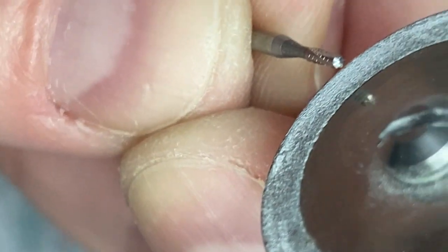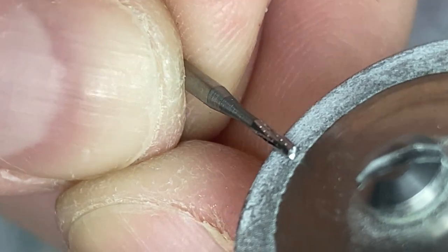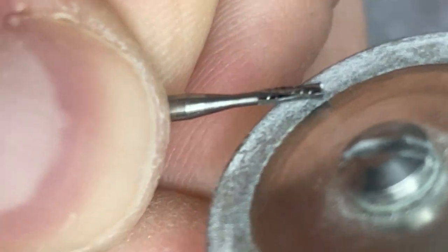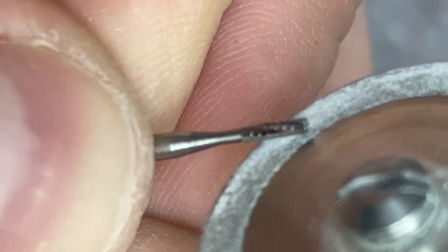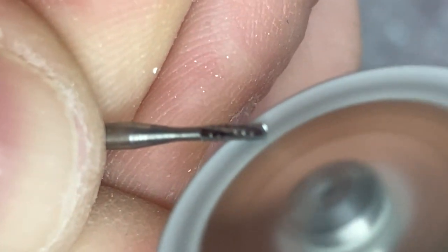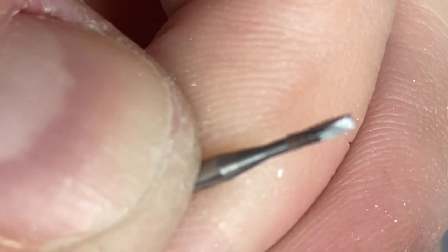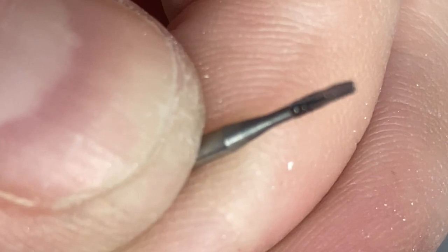You just need an old diamond disk — this one has been used to cut models. Take the burr, hold it, and put it on the disk, holding it on the side like this.